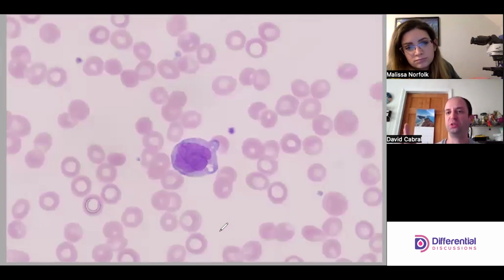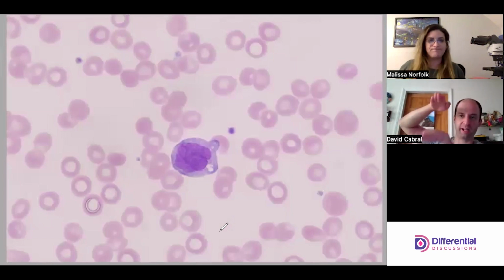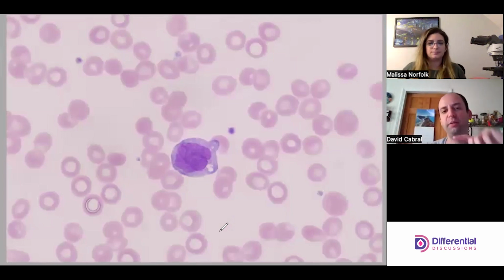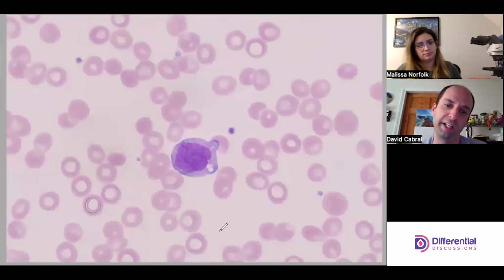A little unusual to see a dark line like that. But it looks like it's folded and we're getting those two tiers. I think we talked about this a little bit when we talked about M3 and the butterfly nucleus. Intuitively, we can tell that there's a difference in elevation between those two sections of the nucleus.